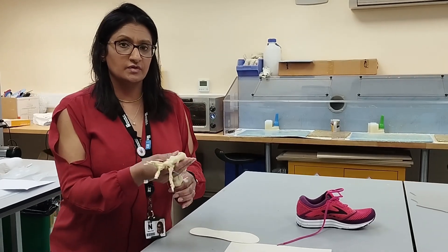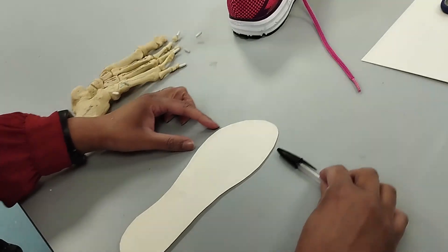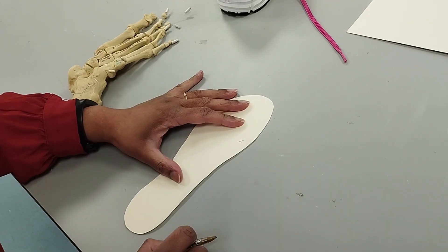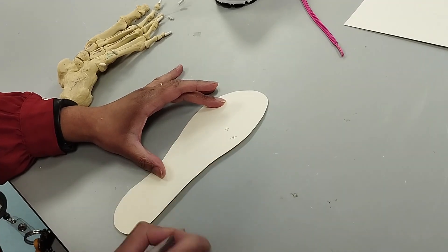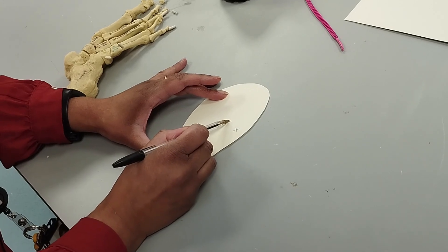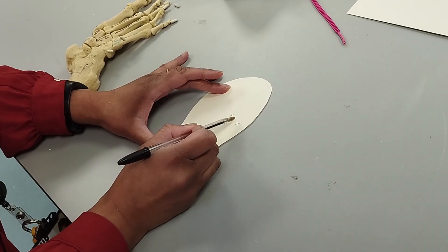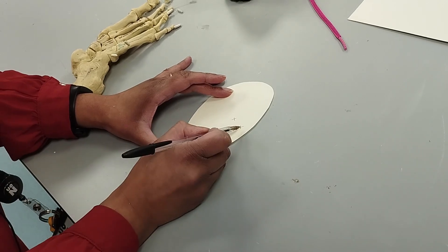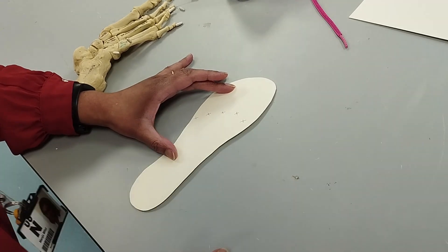Approximately, where do they sit on the template? Go to the widest point of the inlay — about half a centimetre below that will be the first metatarsal head. Then go about a centimetre and a half across and you'll find the second met, which generally sits slightly higher than the first. We're looking at the metatarsal parabola, which goes in a curve — normally the order is 2, 1, 3, 4, 5, or it could be 2, 3, 1, 4, 5. So you mark 1, 2 going up, then downward again for 3, 4, 5. That gives you all five metatarsal heads marked.